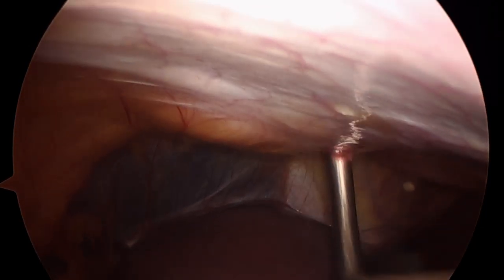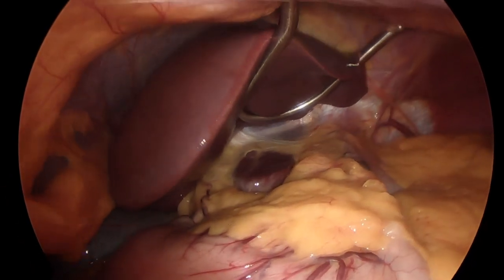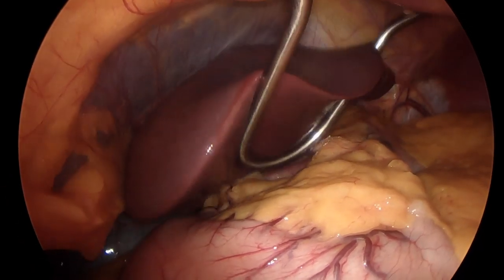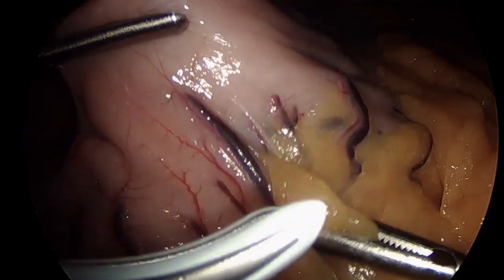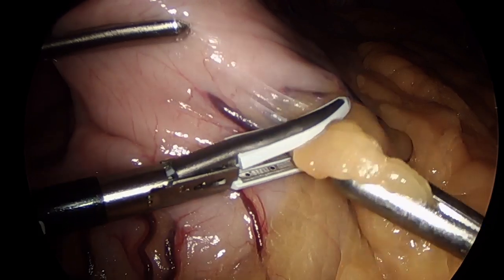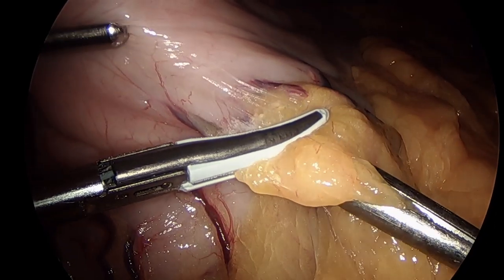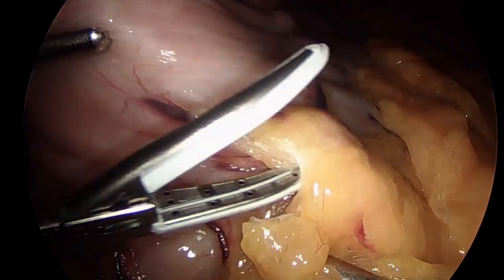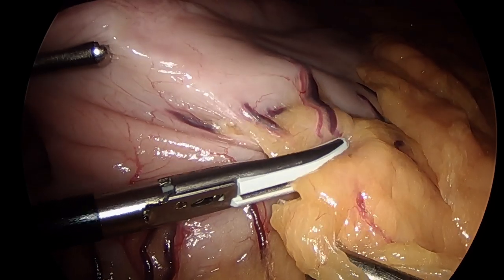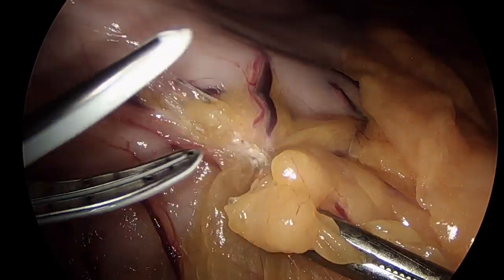The patient is then placed in reverse Trendelenburg. A Nathanson liver retractor is then inserted into the abdomen through a subxiphoid stab incision, which is attached to a table-mounted retractor. It is important not to wedge the liver bar directly between the liver lobes, as this may cause liver tearing and bleeding. We also reduce the insufflation pressure to minimize postoperative pain and the physiologic effects related to pneumoperitoneum without compromising the working space or visualization needed to complete the procedure safely.